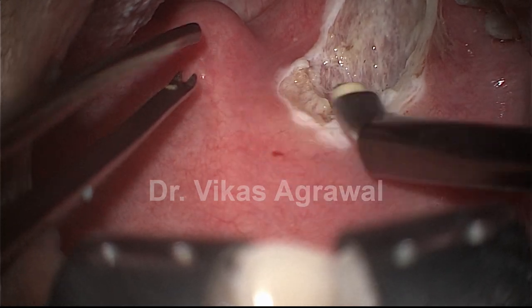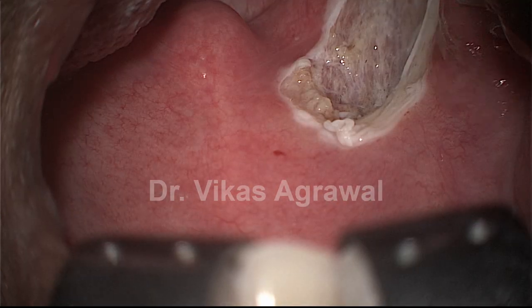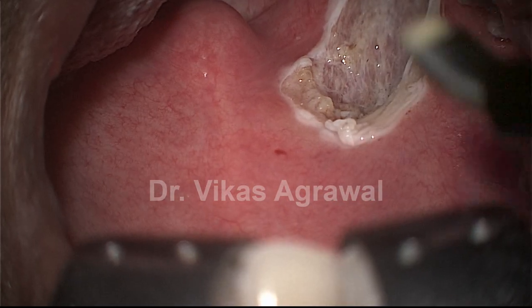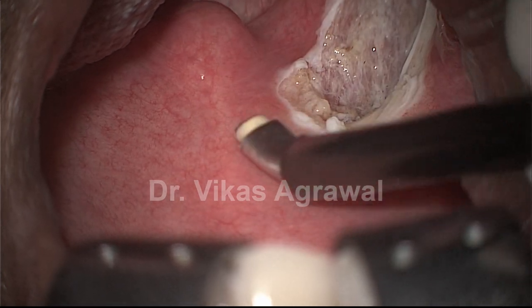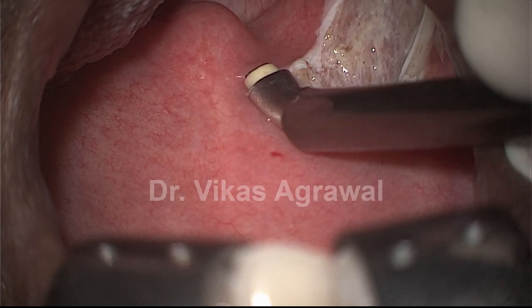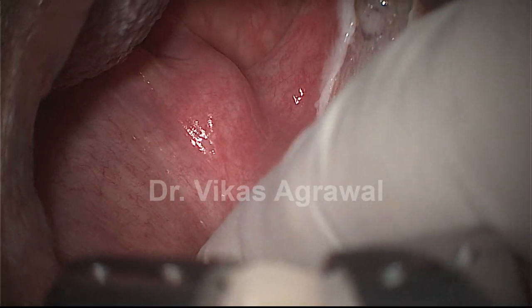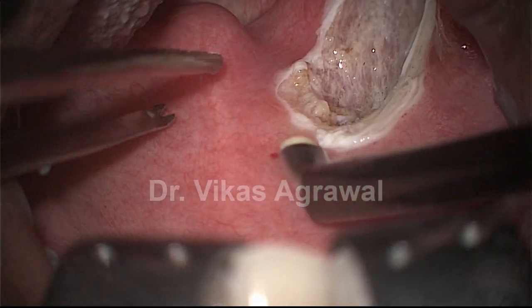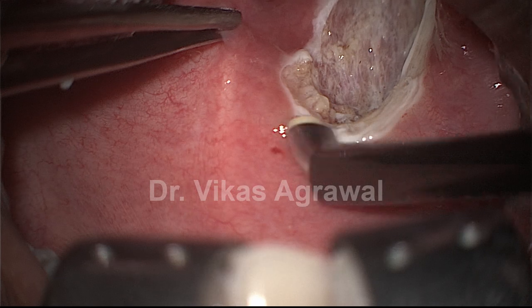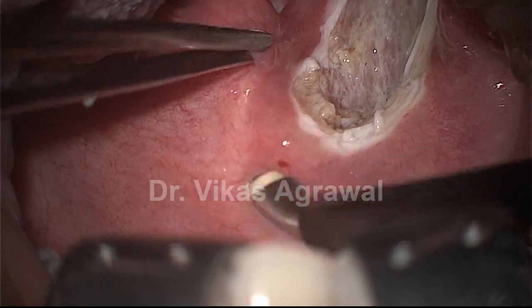The anterior pillar is here — this is the anterior pillar, this is the posterior pillar. So the base of the uvula is low but the anterior pillar is here. The line joining anterior pillar to anterior pillar is your key, and here in this case you can see this is the extra length of the soft palate which we need to remove because this is the cause of his obstructive sleep apnea.